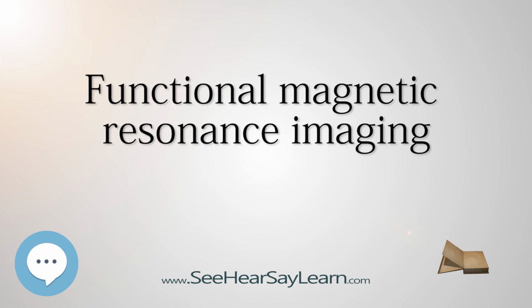A person's strategies to respond or react to a stimulus, and to solve problems, often change over time and over tasks. This generates variations in neural activity from trial to trial within a subject. Across people too, neural activity differs for similar reasons. Researchers often conduct pilot studies to see how participants typically perform for the task under consideration. They also often train subjects how to respond or react in a trial training session prior to the scanning one.